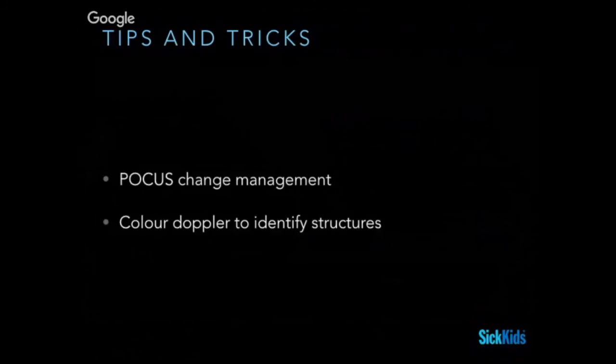So overall tips and tricks for abscess. POCUS does change your management, so definitely consider picking up the probe and use your color Doppler to identify your surrounding structures, so you avoid cutting into things like lymph nodes and vessels.